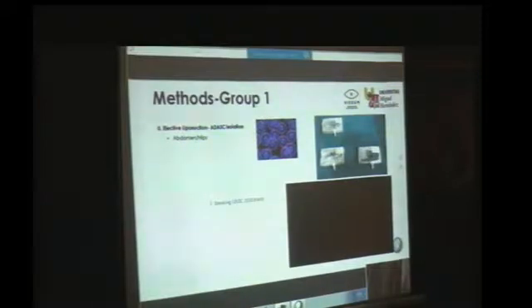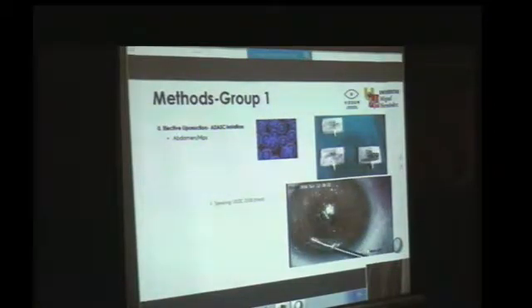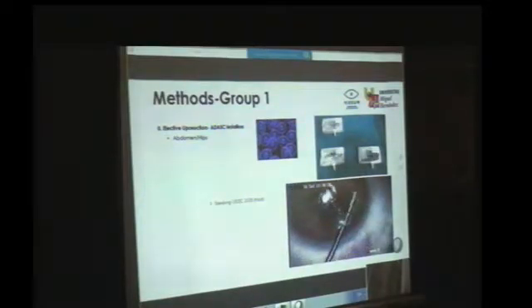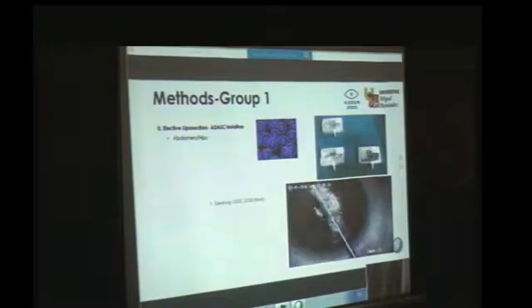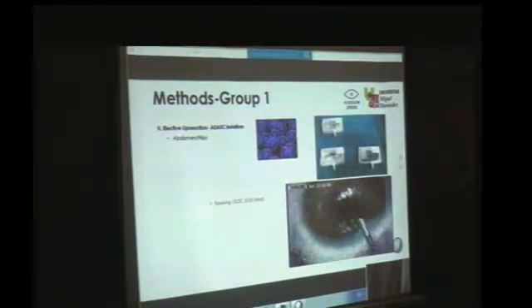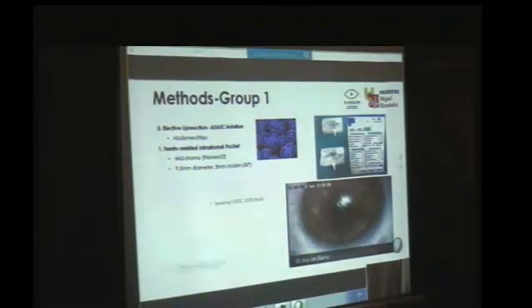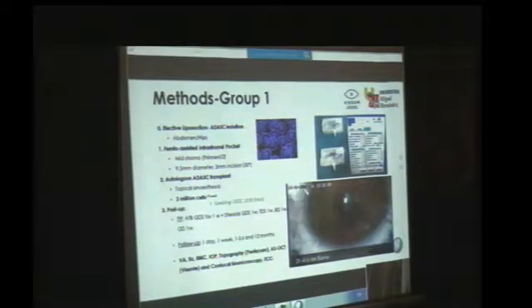We had this type of case in which we had the cells. Here is how we inject the cells into the pocket, with pockets created with femtosecond laser. Well, the same thing like we do in the SMILE, this pocket. This dissection is 9.5 millimeters. We want to have most of the cornea dissected, and the pocket is made at 50% of the thickness of the thinner corneal area. We inject 3 million cells into this pocket and close it only with one stitch. As you see, this surgery takes minutes, and we had a 1 year follow-up of these patients.